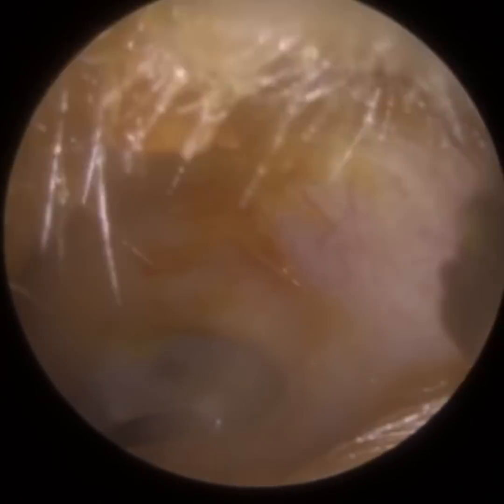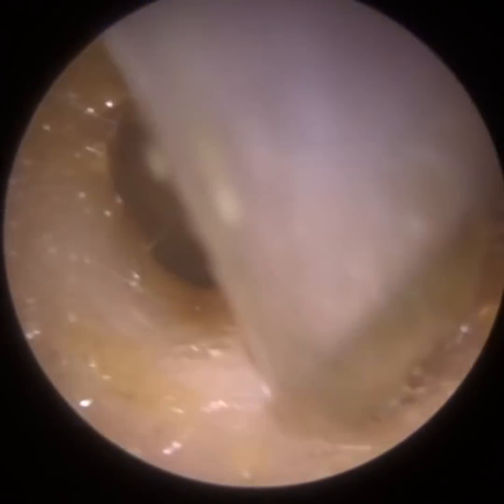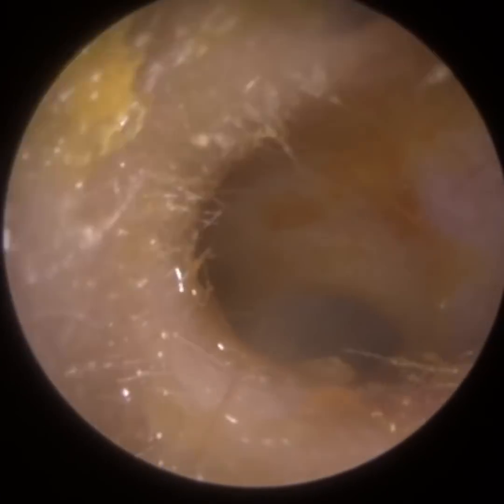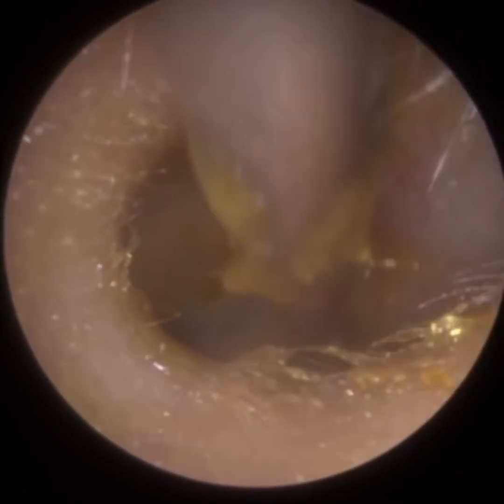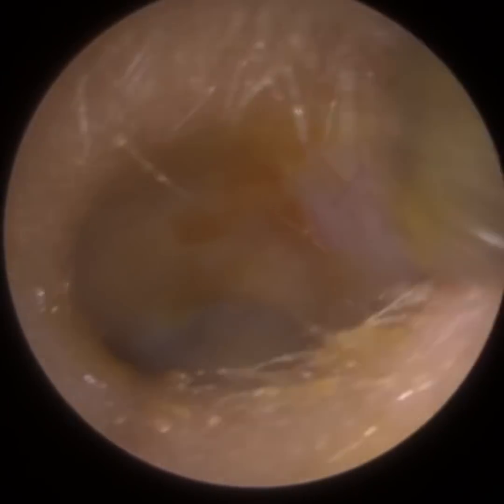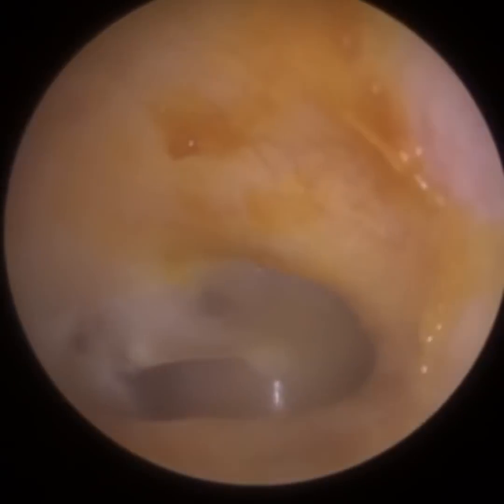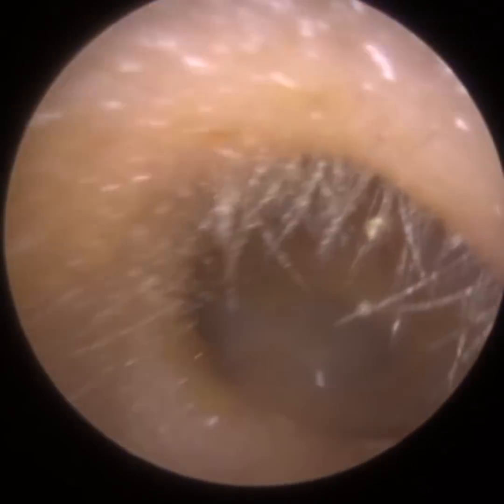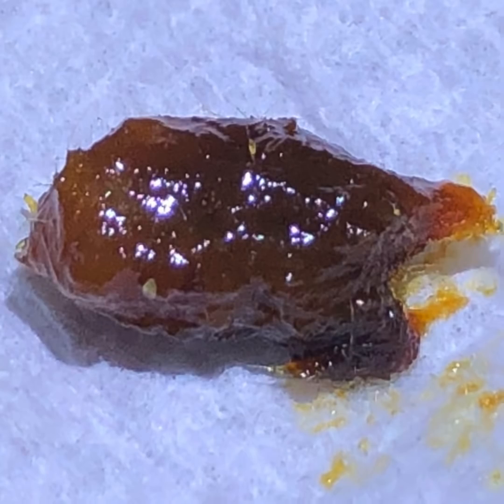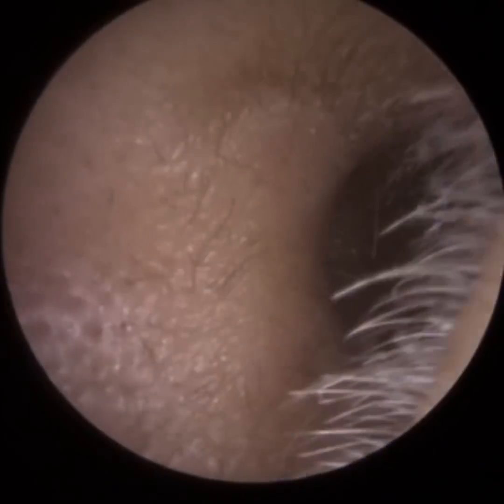Not everyone has it. It's a specific gene mutation, which you're more likely to have if you're of African or European descent. If you're from the Far East or North America, so you have ancestry in that region of the globe, you're more likely to have dry earwax, so you're less likely to have the same sweat gland under your armpit. So that's a still image of that plug I removed from the patient's left ear, a big lump.